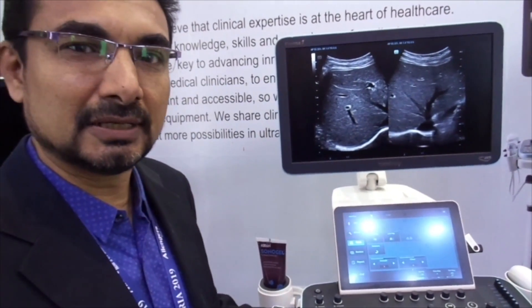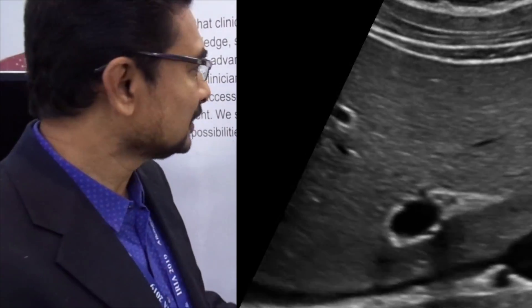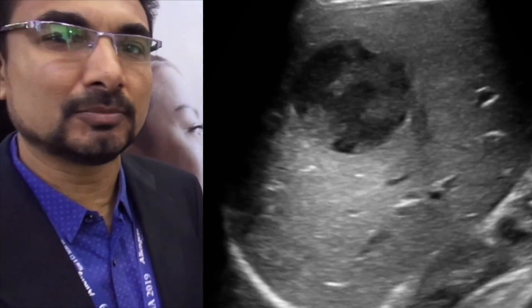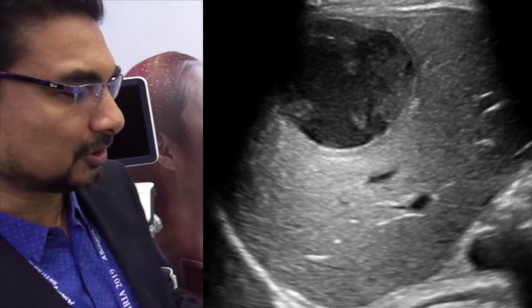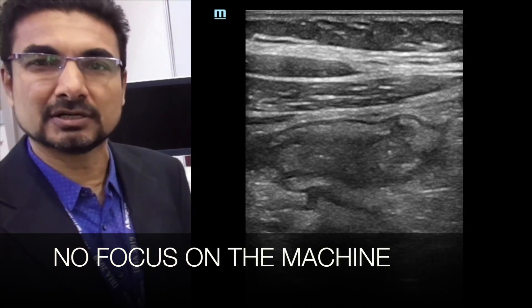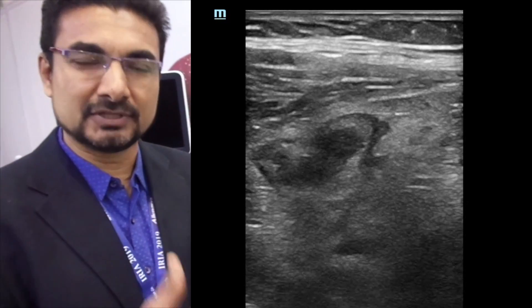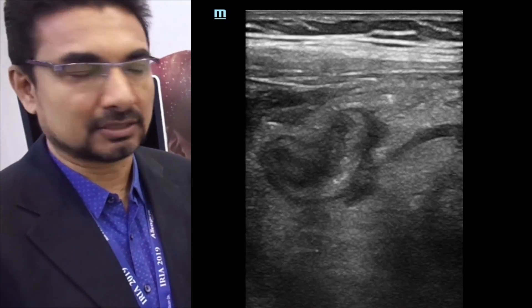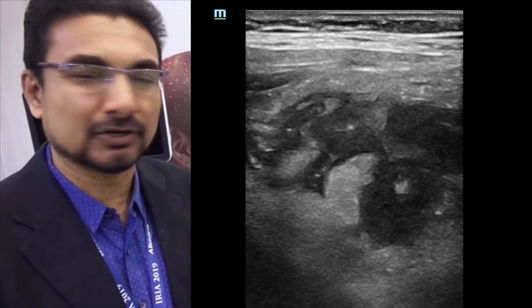The other thing is scanning with the 3.5MHz probe. Almost all of the time you will be able to see the entire liver without much effort, because there is no manual focus in this machine. You don't have to focus on certain areas or zones — everything is focused with the Zone SonixHD technology, so you will see the entire liver without much effort.